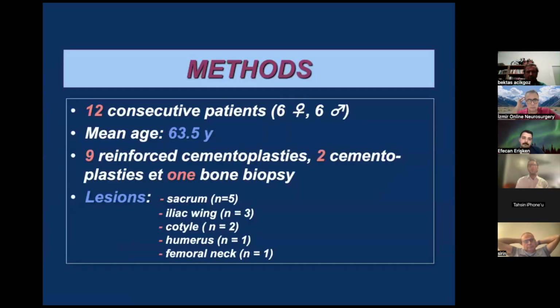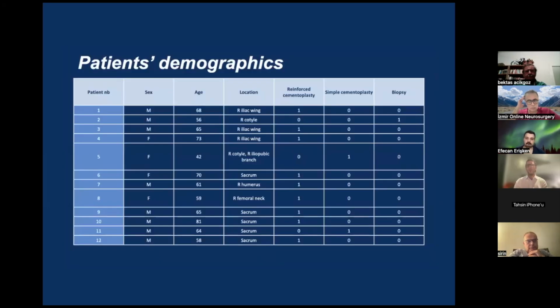So we performed a preliminary study involving 12 consecutive patients using this technique, mostly reinforced cementoplasty and cementoplasty on the sacrum and pelvic bone. This is the patient demographic, so mainly patients with a bone tumor lesion.